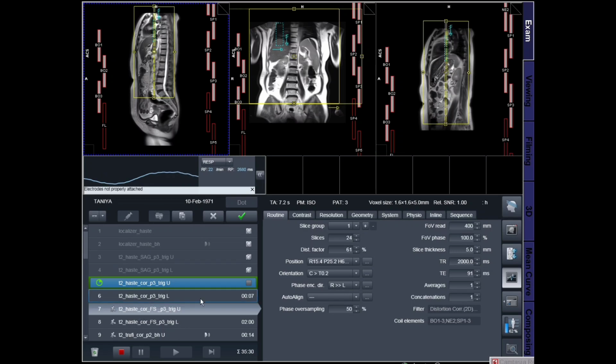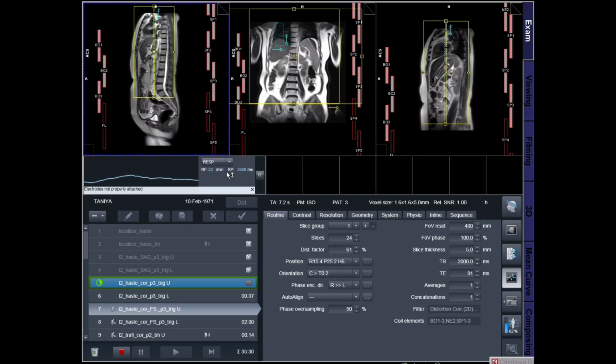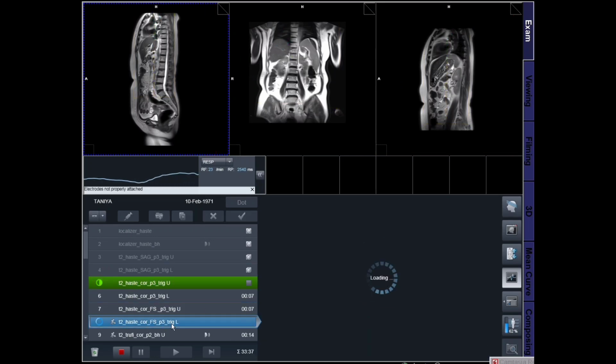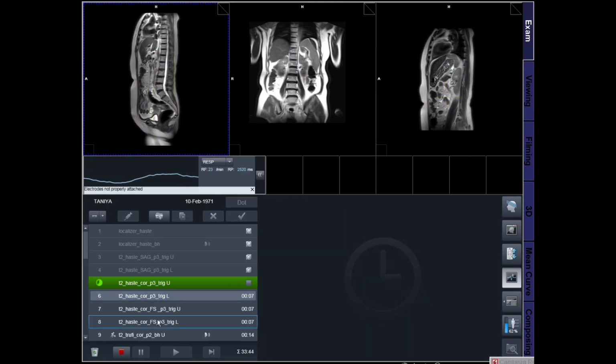Localizer scan. The examination begins with a 3-plane localizer scan. Localizer images are obtained in axial, coronal, and sagittal planes to confirm anatomical coverage of the abdomen.